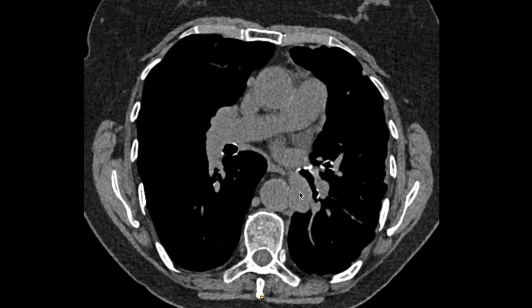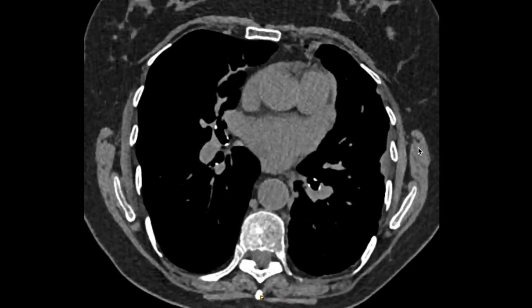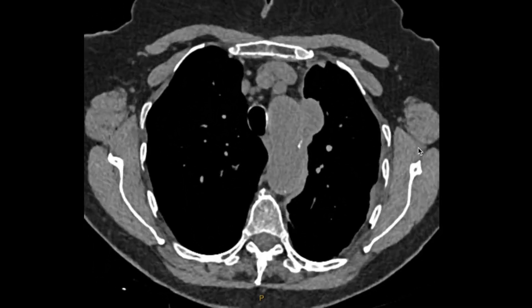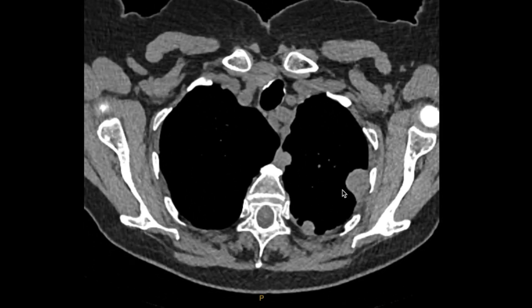This probably provides an easier way to biopsy than doing it surgically, especially given that this lady has had a prior surgical procedure and pleurodesis, which would make surgery very difficult because the lung and pleura are stuck to the chest wall. CT-guided biopsy is another option which may be able to reach one of the more peripheral pleural nodules, but note that the scapula is in the way. So I'll show you how this was performed bronchoscopically.